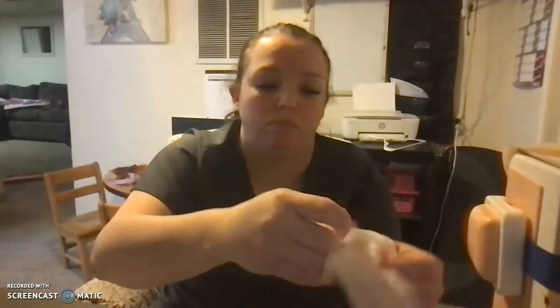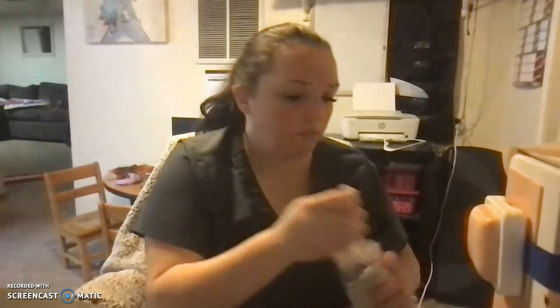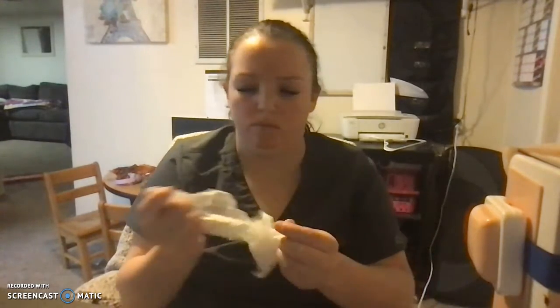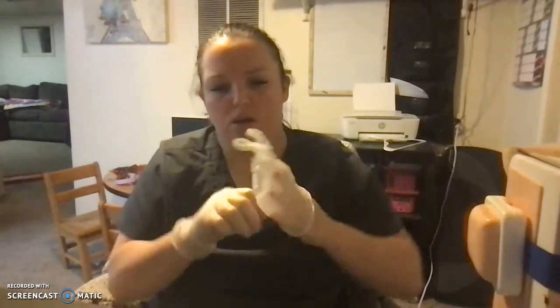I would perform hand hygiene. I would glove up. Okay, so let me grab a different pair of gloves.